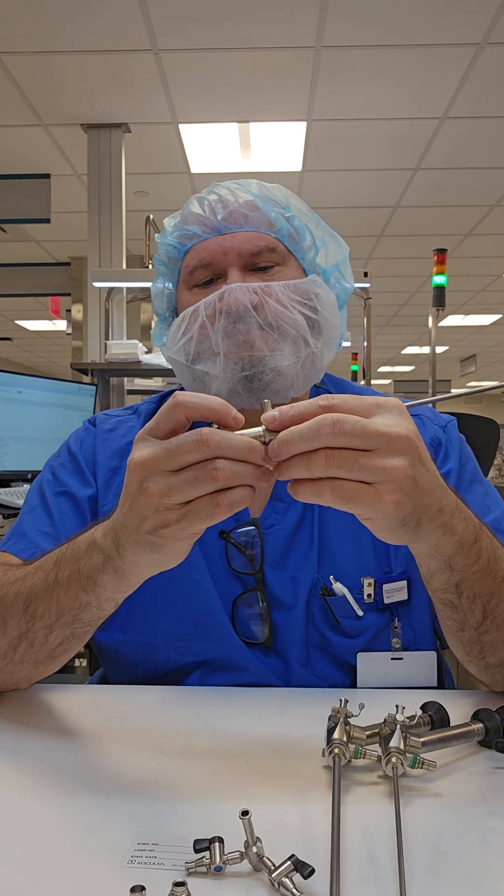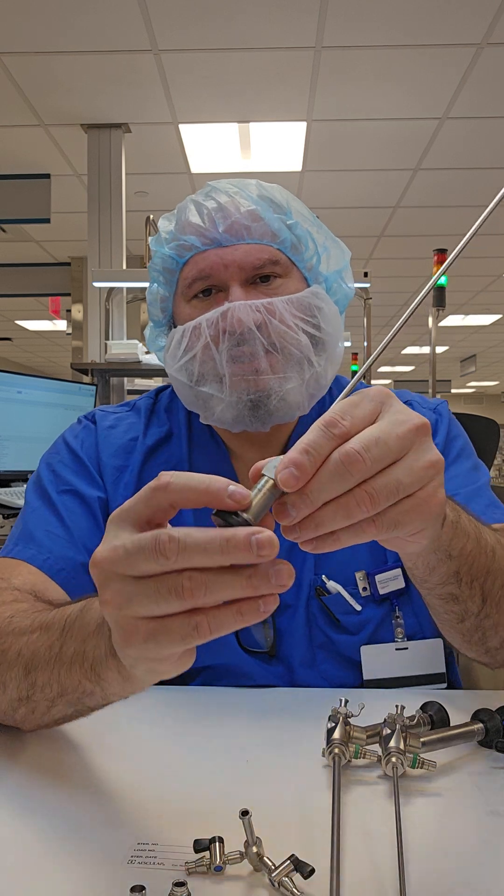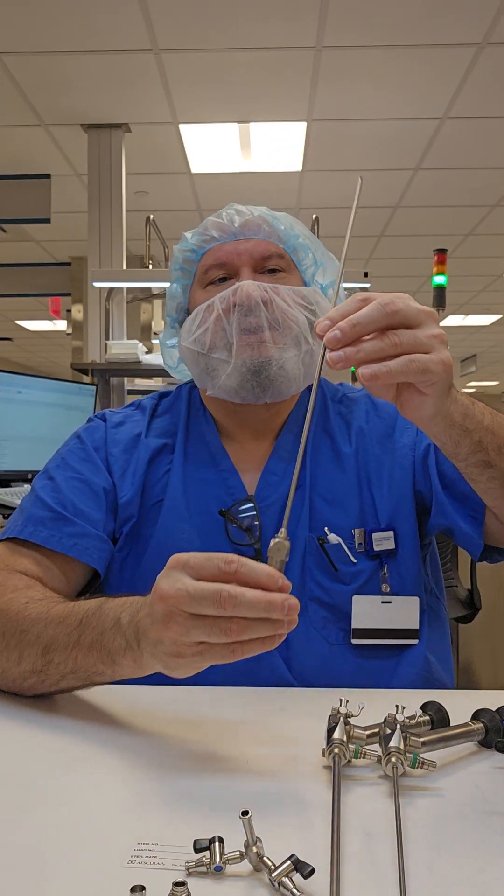How do you know the angle of your scope? It should be listed on the actual eyepiece body. For example, this is a 70-degree scope here.